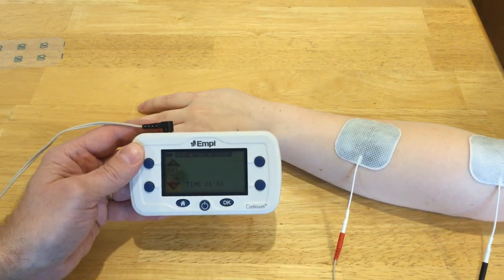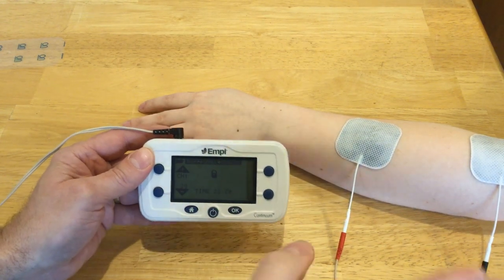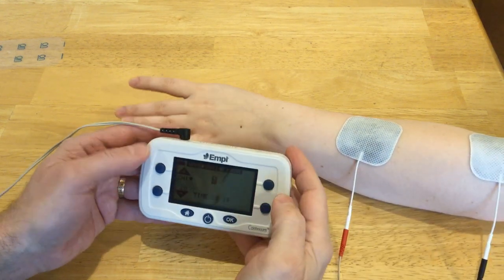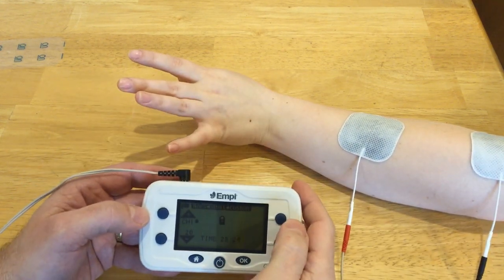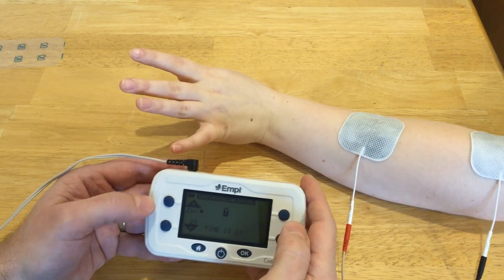If you're stimulating the shoulder, back, leg, or maybe even the upper arm you could probably get away with a large electrode, but it's a little hard in the forearm to hit just what you want with such a large electrode.